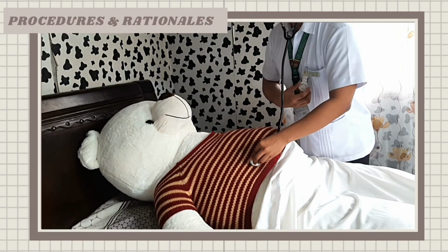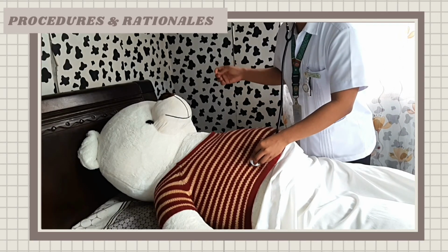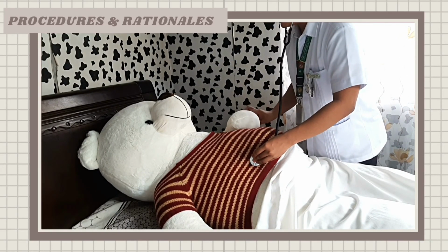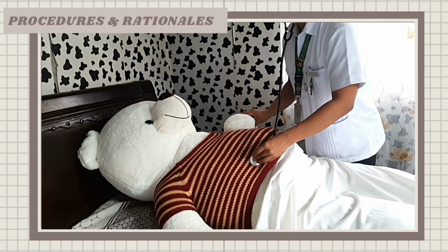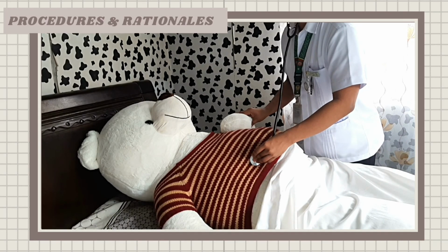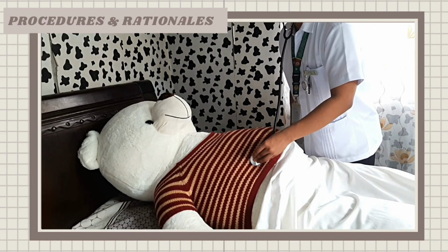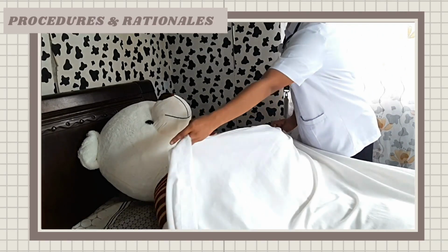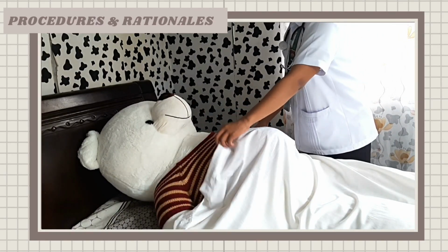To verify the heart tone, compare by obtaining maternal radial pulse while listening to the fetal heart tone. This will verify the accuracy of fetal heart tone. Now count the number of beats for 1 full minute to determine pulse rate. After that, document the data or findings for accountability purposes.